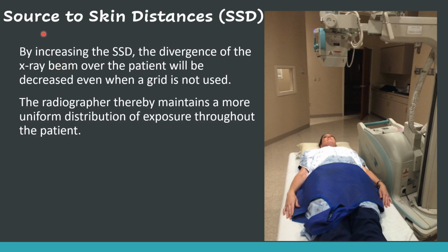By increasing the SSD, the divergence of the X-ray beam over the patient will be decreased, even when a grid is not used. The radiographer thereby maintains a more uniform distribution of exposure throughout the patient.